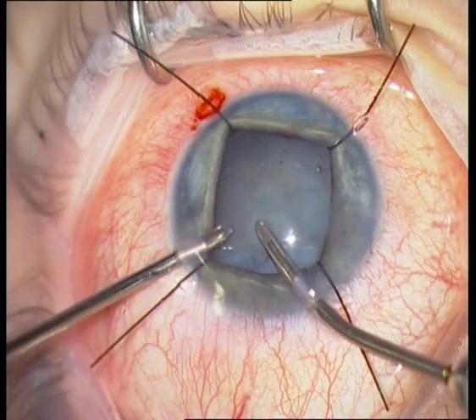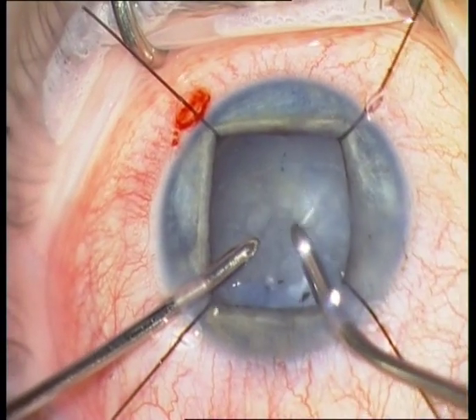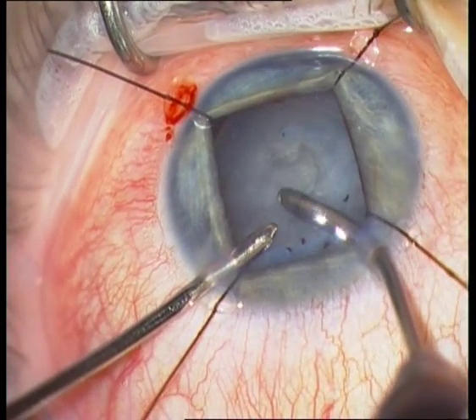The next step is irrigation aspiration. This is the eye of a young patient, so the nucleus is very soft and can be simply removed with irrigation aspiration.